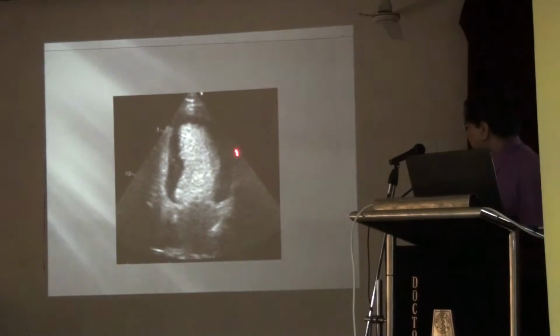Contrast echo is now an established modality. Generally we don't practice it, but many doctors, particularly in the Western world, do. Dr. Sanyal from Eastern Railway was there. He went to London, and he was very famous in the echo world as Dr. Roxy Senior. He was from the railways and a very expert, particularly famous for contrast echo, and he developed lot of contrast echo. Even for acute MI they are saying we used to do it. So many contrast echo applications exist.